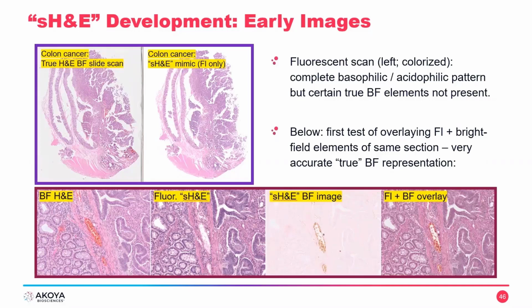These images may be good enough under certain circumstances, but if you would like for those things to be incorporated, it is possible via what is represented along the bottom, that being on the far left, a 20x magnification frame from the sample immediately above it, showing some RBCs in dark red there, flanking some colon cancer tissue cell types.